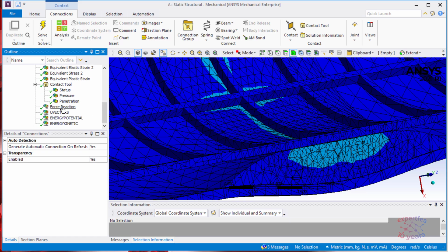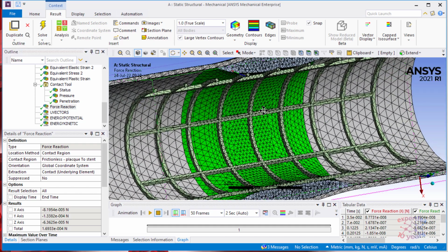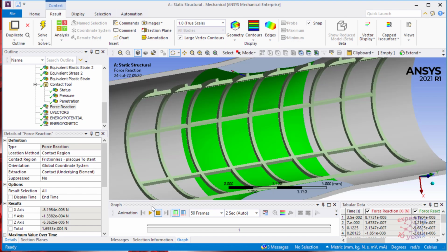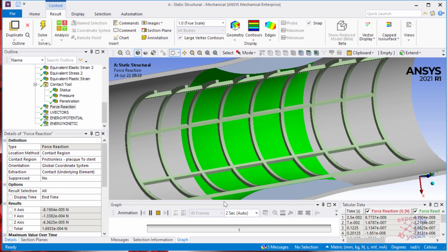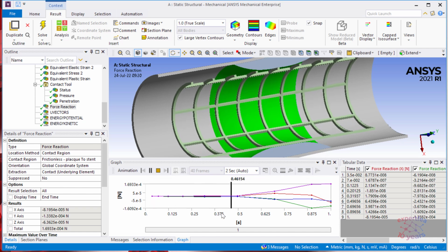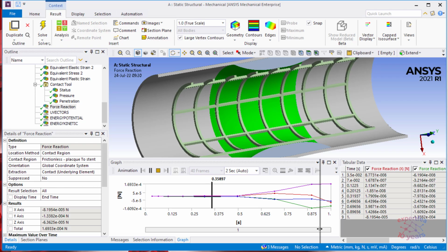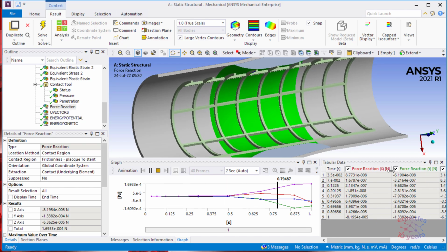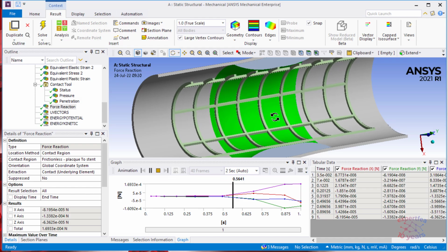Let's look a little at the force reaction between the stent and the plaque. Let's hide the elements a little. Maybe 40 frames to be faster. So this is the force reaction. Let's see some values. They are pretty small values, considering that one of the sides is much softer.